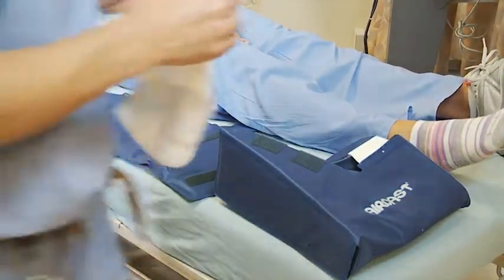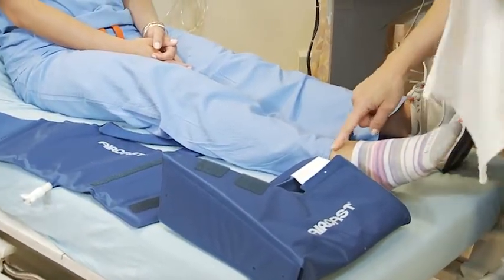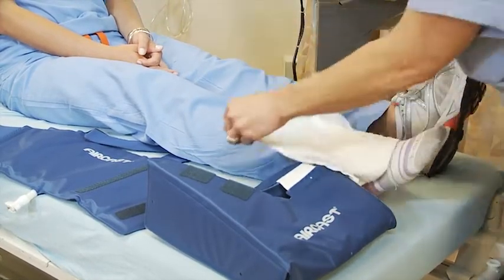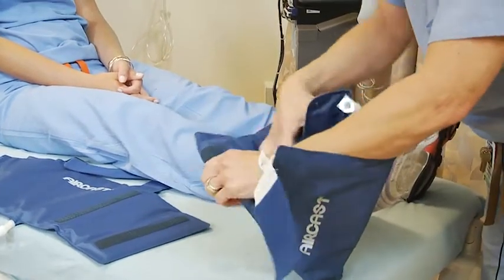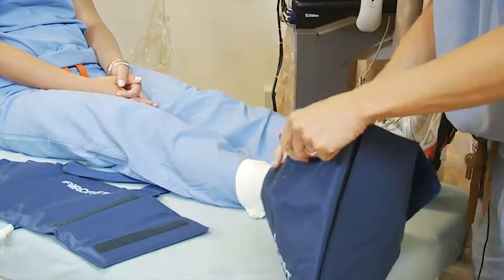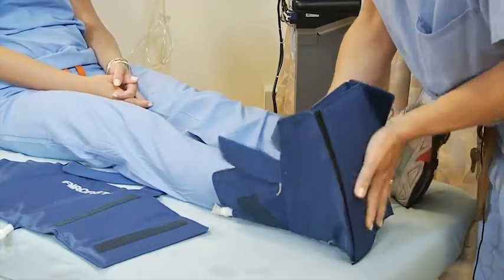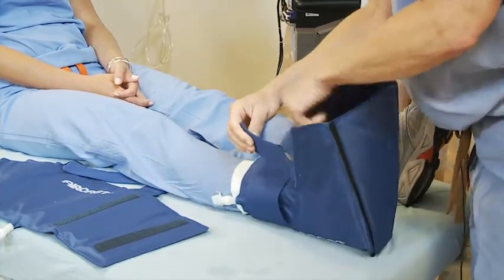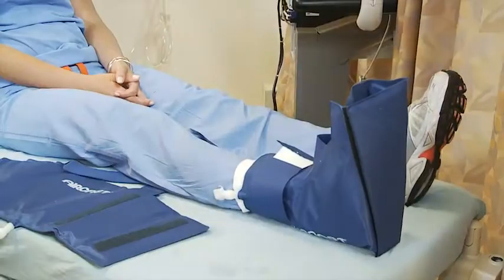You always want to put a protective between the skin and the pad. So usually if you have shorts or exposure like this, just put a face cloth around. Then the foot connector is a hard surface. You're going to bring the foot into the ankle wrap. Lift it in and push it up against that firm base. And then wrap with the Velcro straps around the whole foot.